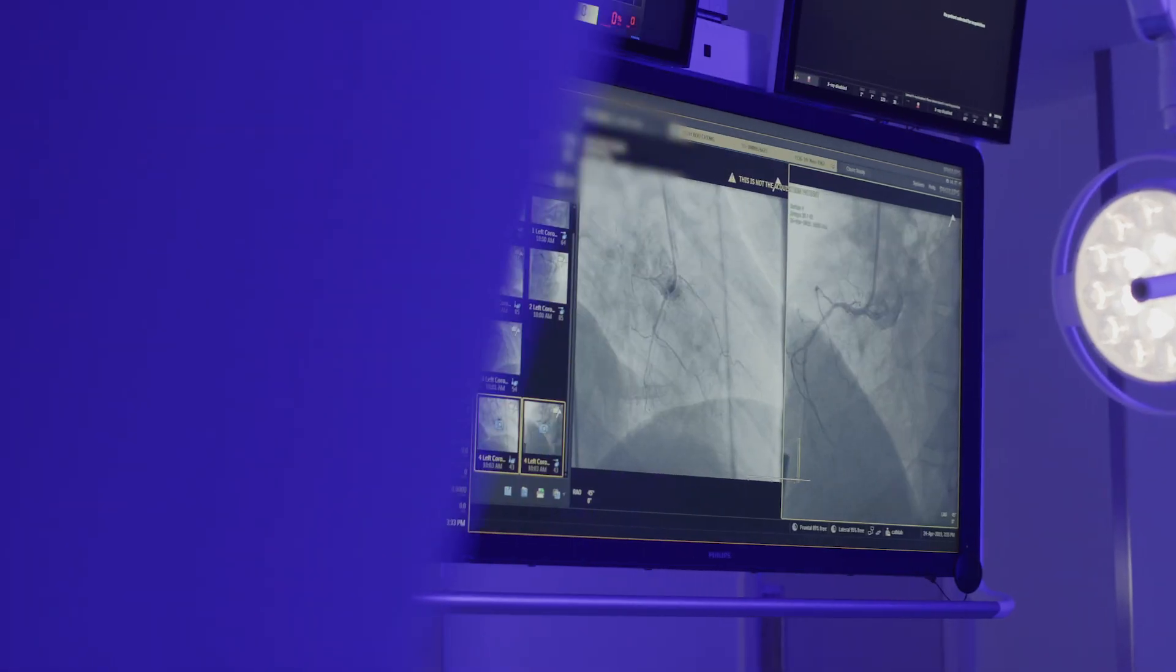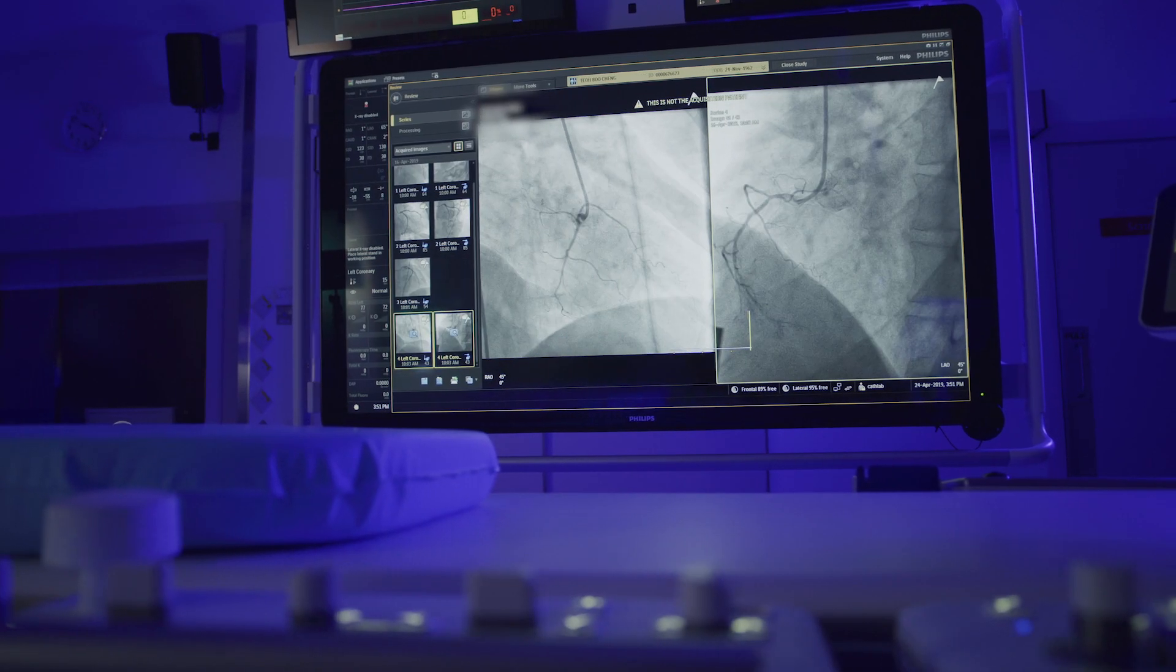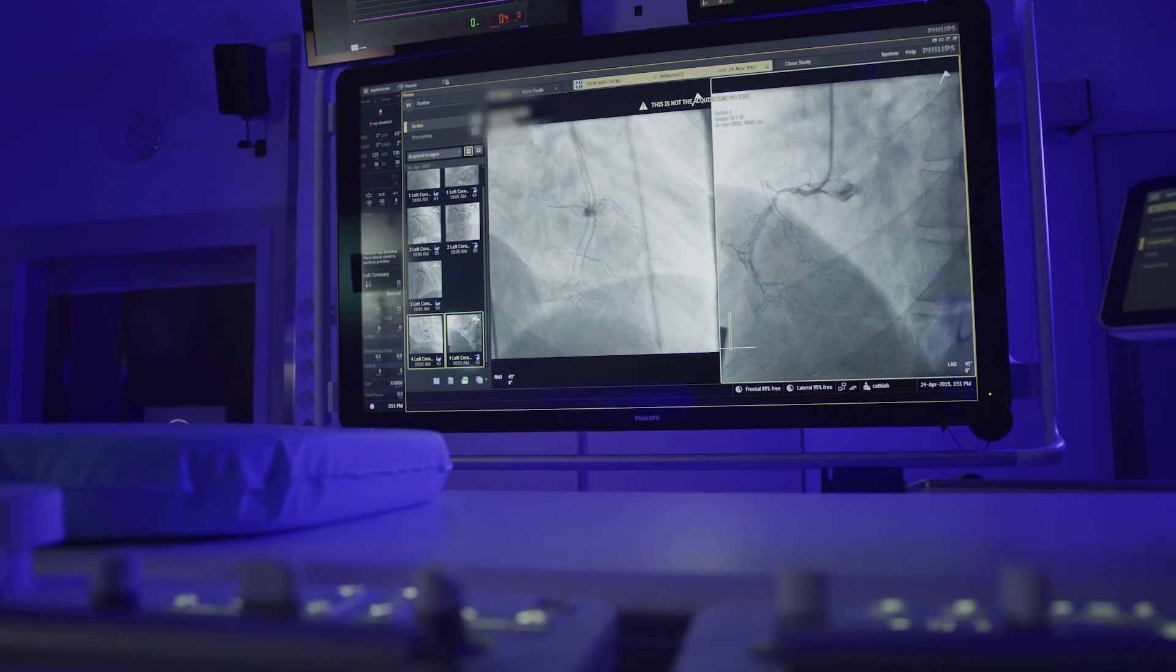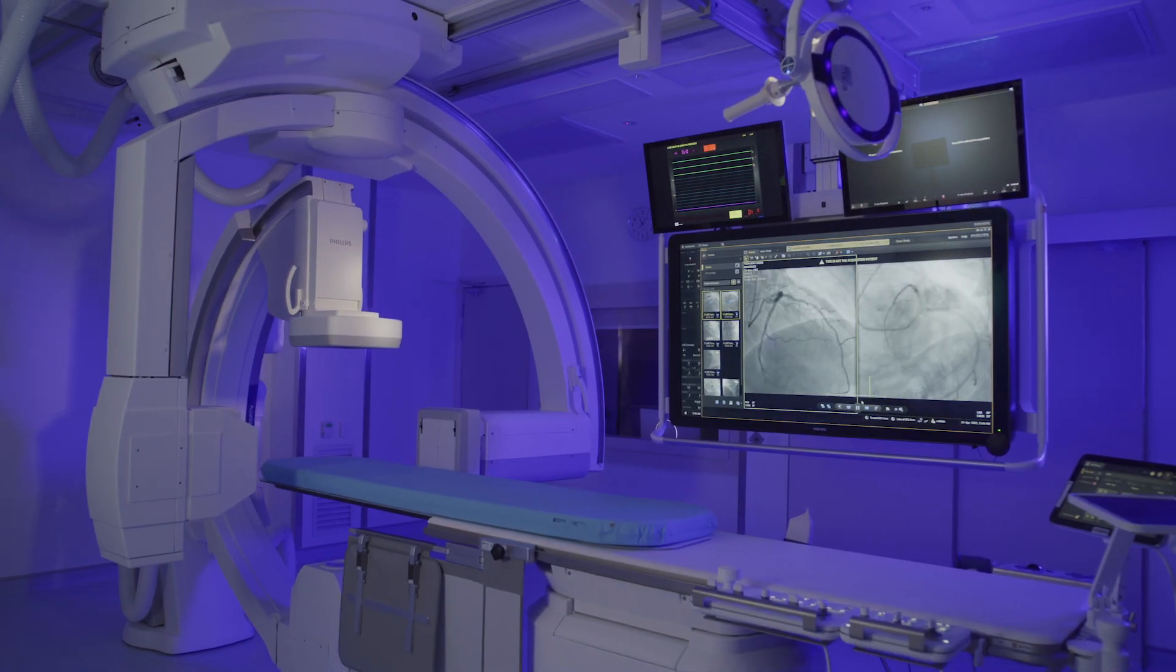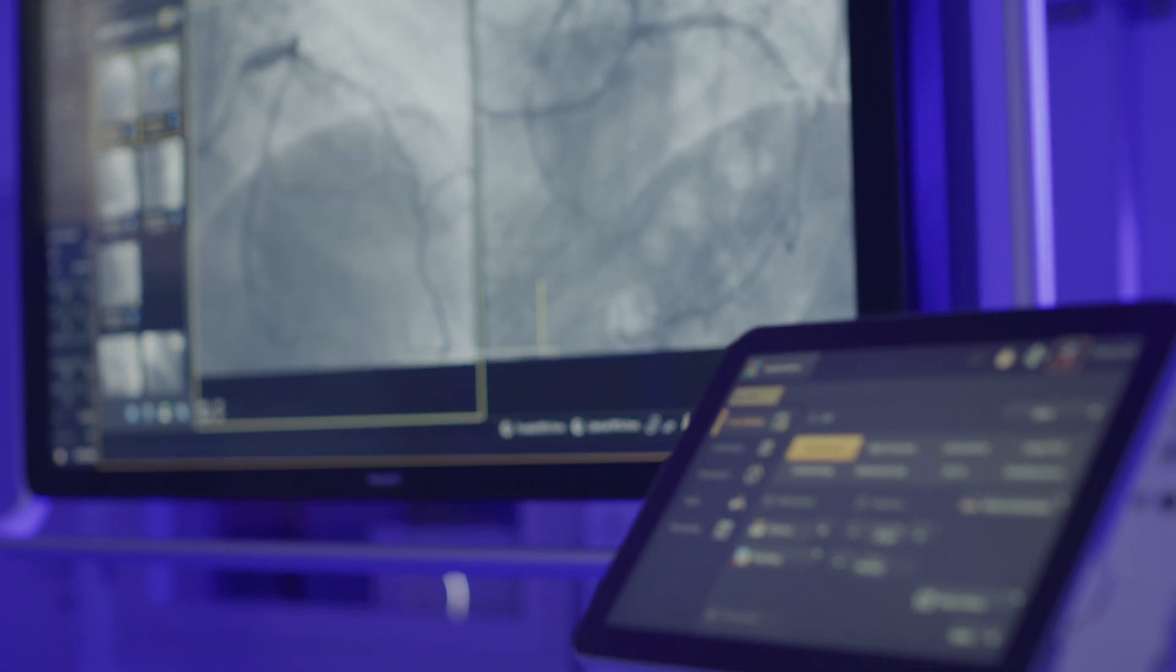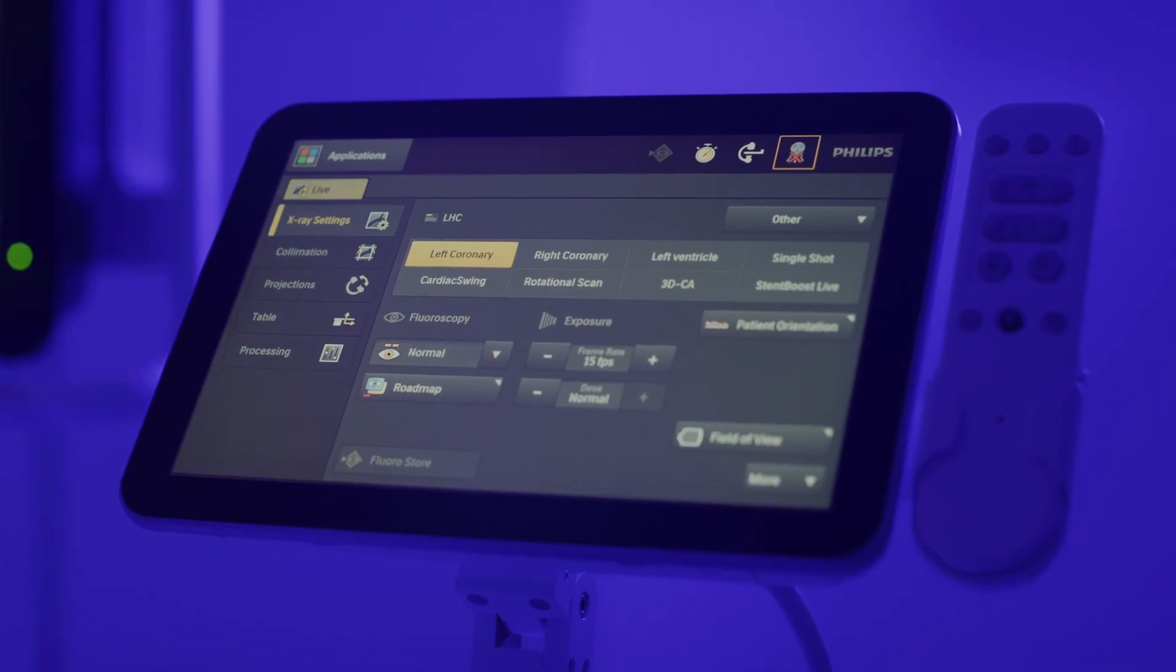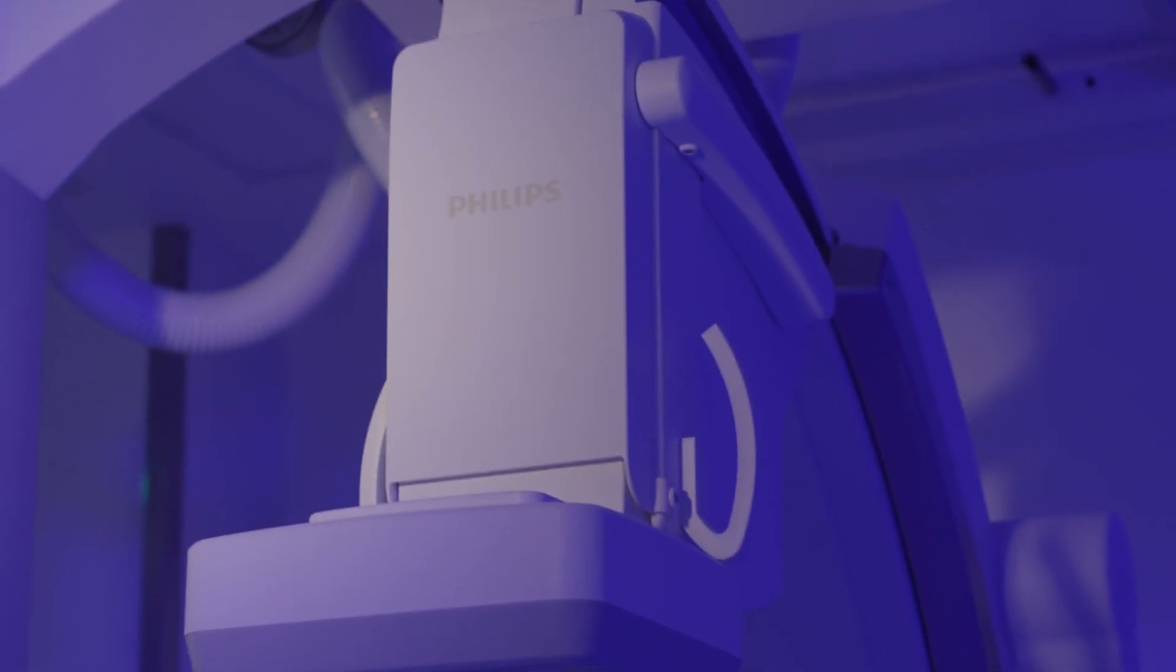With a next-generation precision image-guided therapy system, it provides crystal-clear imaging for complex procedures, such as neural, cardiac, and peripheral vascular, where life-saving decisions can be made in an instant.